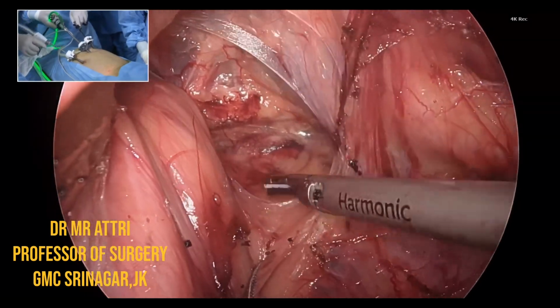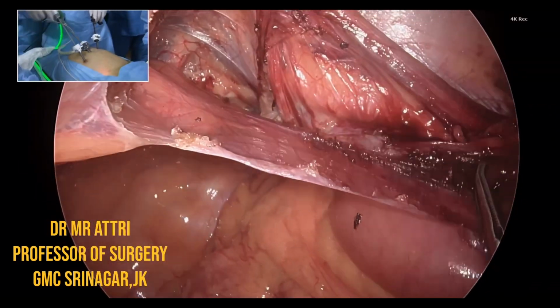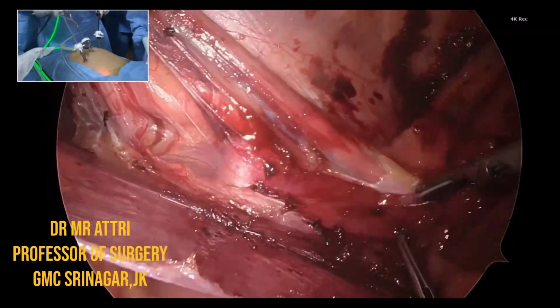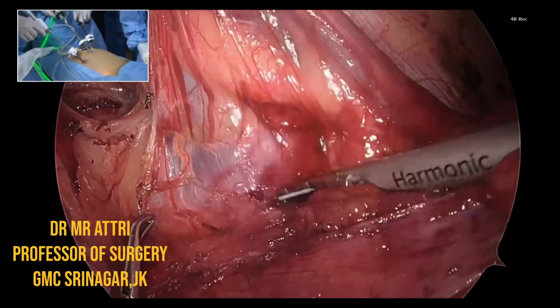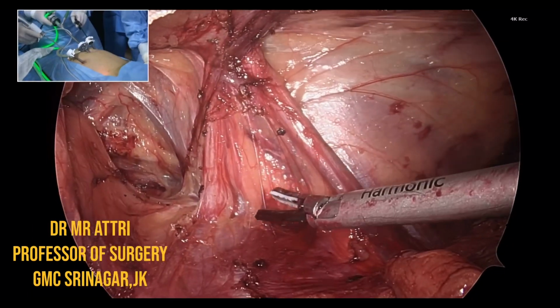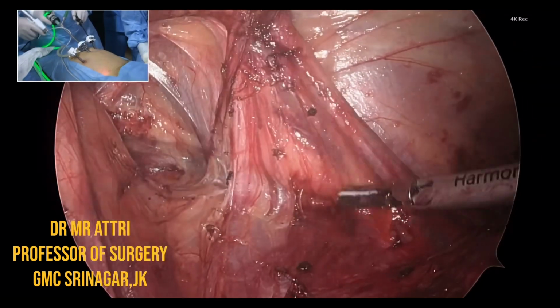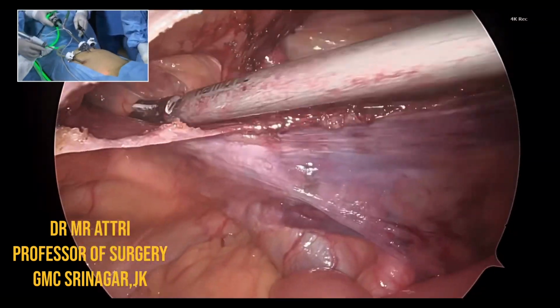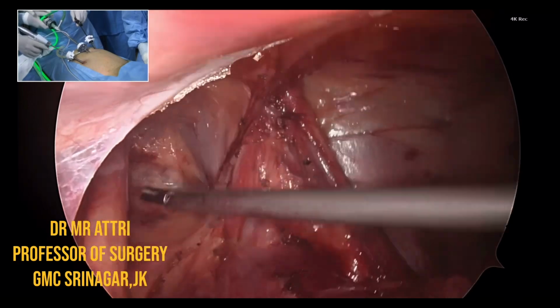So I think we have now more or less been on the ETEP journey for 6, 7 years. Many of us are there. So we've realized that ETEP is a technically demanding surgery. We are cutting the PRS from one side to the other side to enter that space. Space creation is pretty good with ETEP, there is no doubt. You can put in a big mesh. The question that we are now asking after this journey is, do we need that kind of space? Do we need to cut somebody's PRS? Do we need a mesh which is 20 by 20 for a hole which is 2 centimeters?